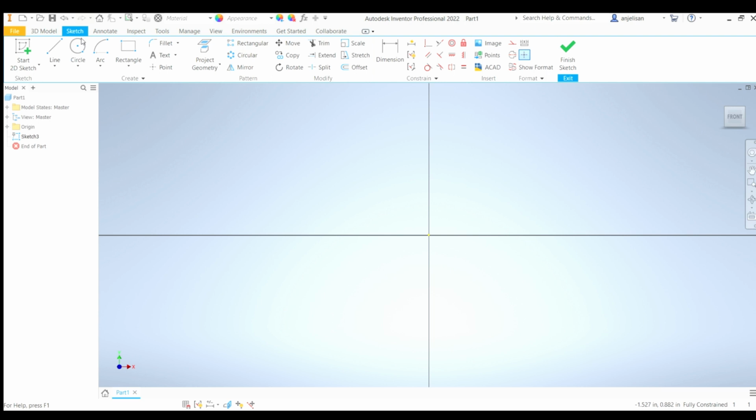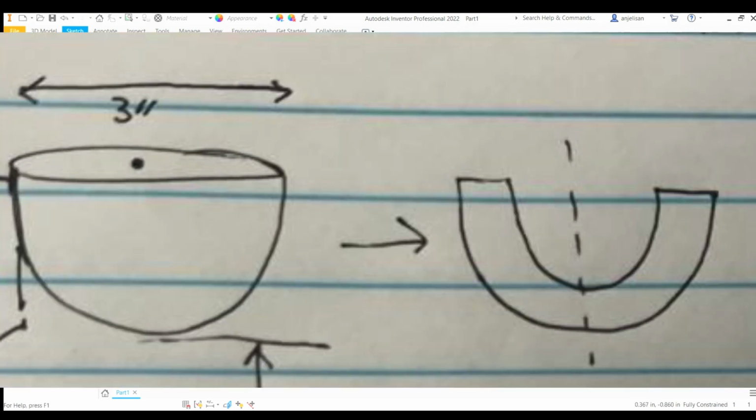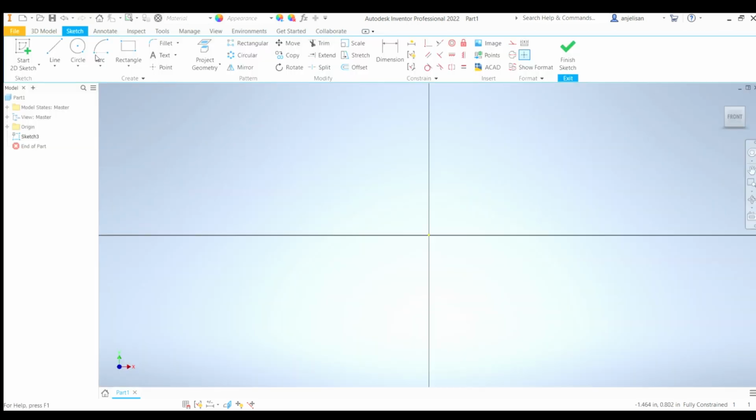So the first thing that we did was designing a cup. This is what's going to be holding the amputation. So as I mentioned before, if we slice this cup in half, we get a sort of U shape, right? So we're going to be making half of that cross section. The way we can do this is we can go down to arc, go down the drop down, and hit center point. So now we're going to place the first point somewhere along the positive y-axis. It doesn't really matter for now.